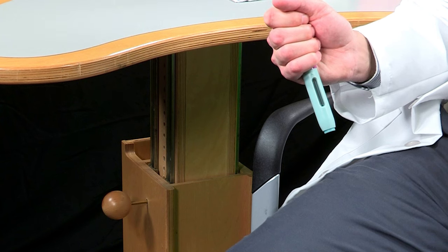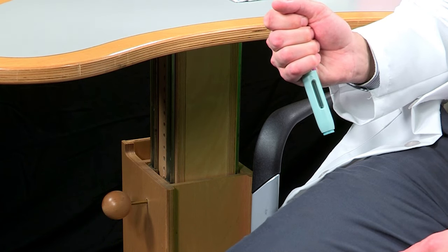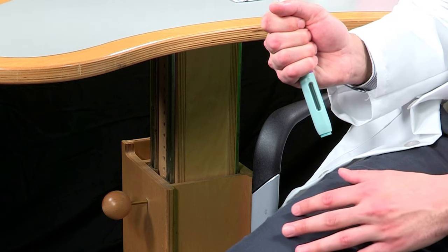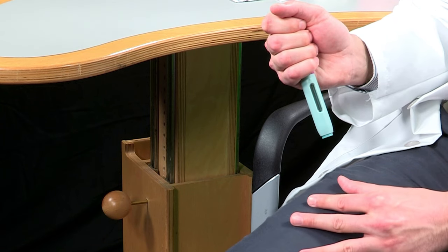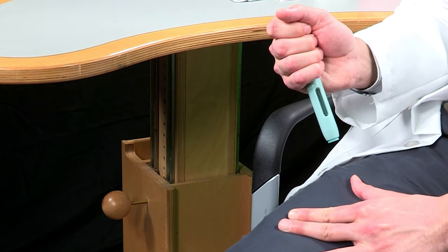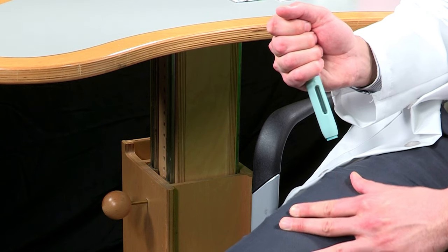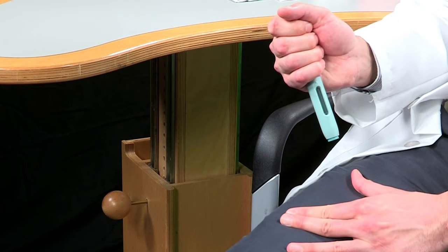Create a firm surface around the target site, either by using the stretch method or the pinch method. For the stretch method, stretch the skin firmly by moving your thumb and fingers in opposite directions, creating an area about 2 inches wide.